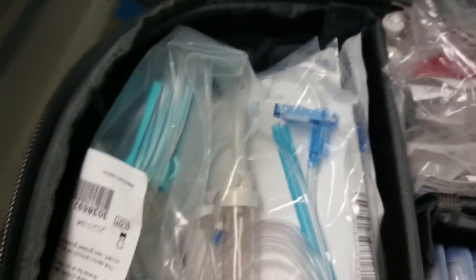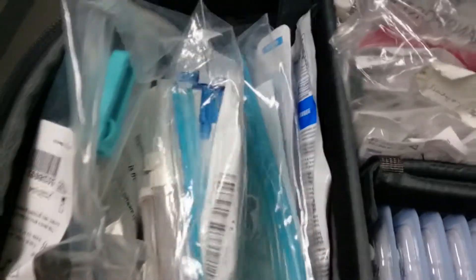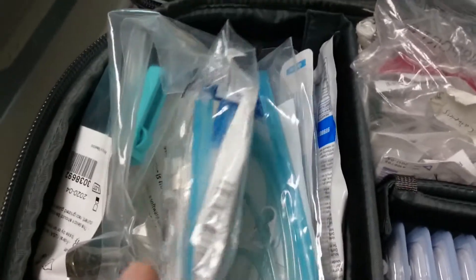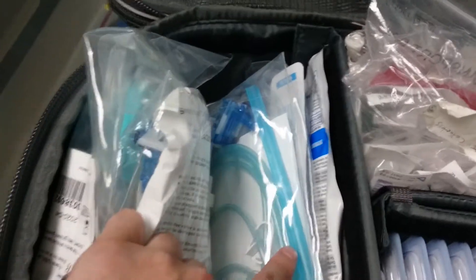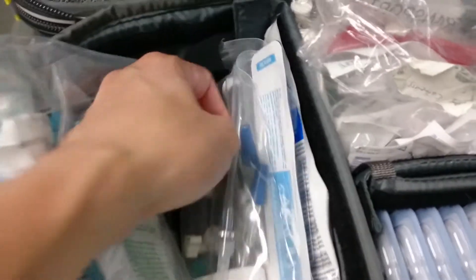Over on this side, we have the ISTAT, the pressure bag, and a lot of IV tubing. We have the code tubing — we usually have at least two of these. Some regular tubing in case we need to put meds on a pump. The TPN/amio tubing just in case we're on amio. We also have ART lines, defibrillator pads, and ART line tubing down here.